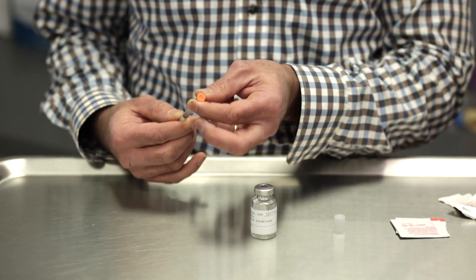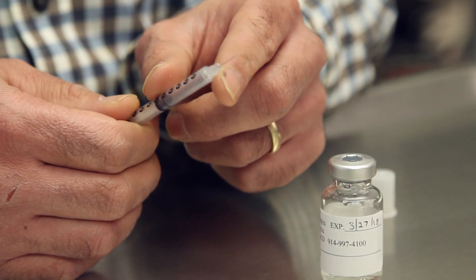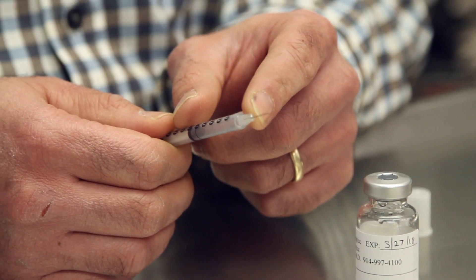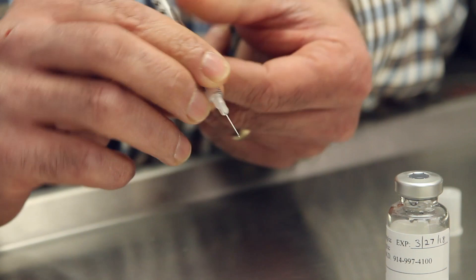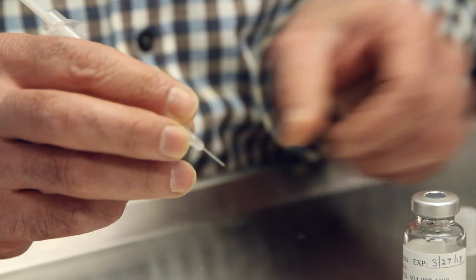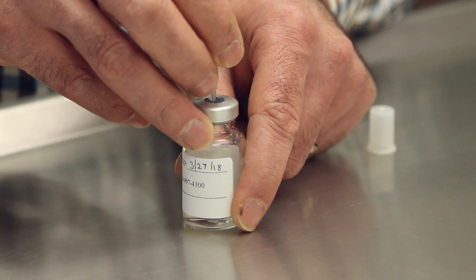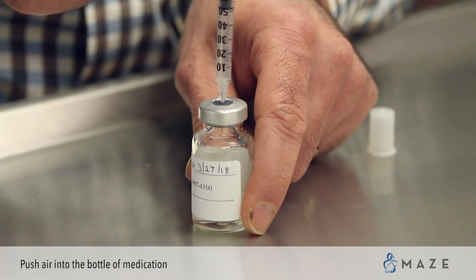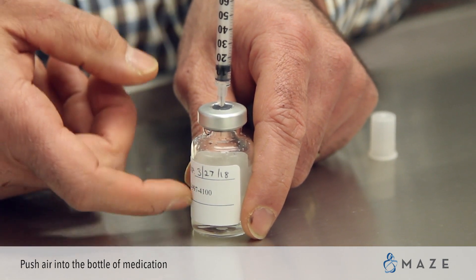At that point, remove the orange cap to reveal the needle. The needle is very flimsy, so take great care not to bend it. Hold the needle very close to the needle hub. Go straight into the rubber stopper with the needle, then depress the stopper, pushing air into the bottle.